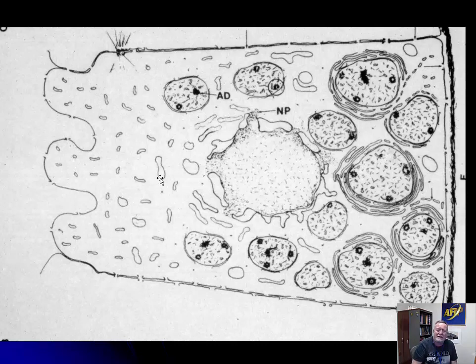They're usually the last thing to hang on, at least in an epithelial cell, in these stages. But then eventually the cells will swell so much they'll rip apart. The cell will release from the basement membrane and will float off and just become part of the necrotic debris.